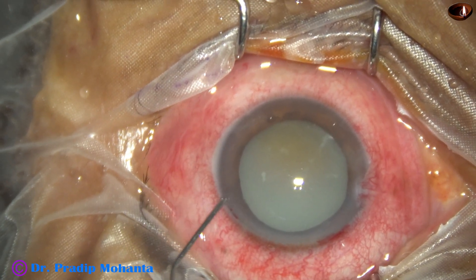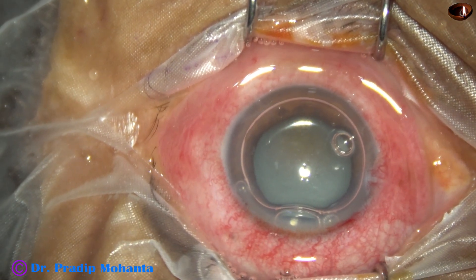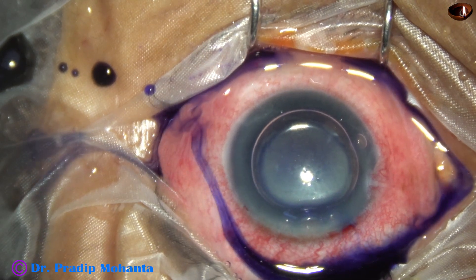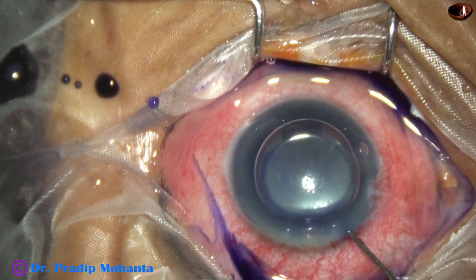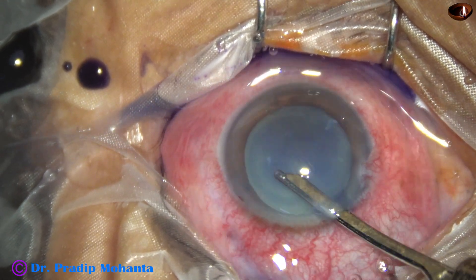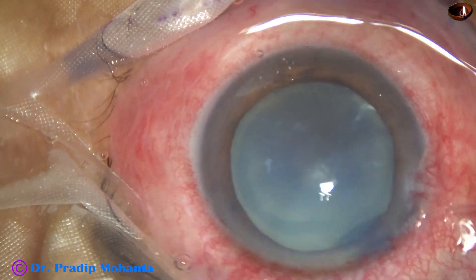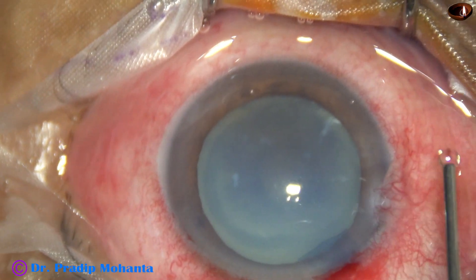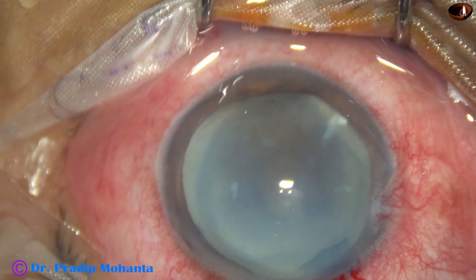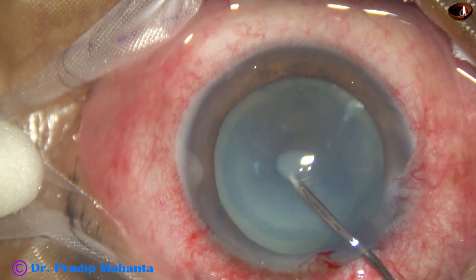We have to put the patient on acetazolamide, and the patient has to bear the side effects, which are very bothersome. By this time we have made a side port and now we are going to stain the anterior capsule underneath this air bubble. This is a bit of adrenaline to keep the pupil dilated during surgery. Now I always wash the dye out and then fill up the anterior chamber with viscoelastic — this keeps a uniform environment, and the concentration of dye is uniform all around, giving better visibility. Some viscoelastic over the cornea for better visibility. In this case it is not a good idea to initiate capsulorrhexis with the utrata forceps.